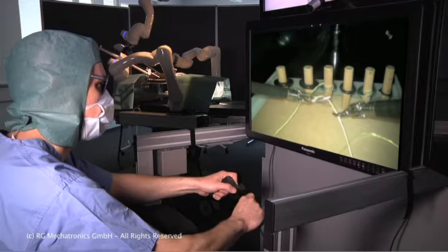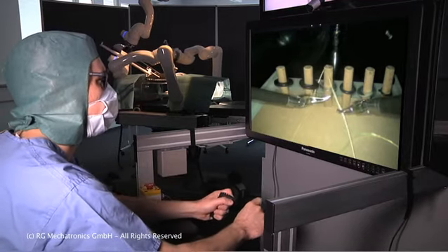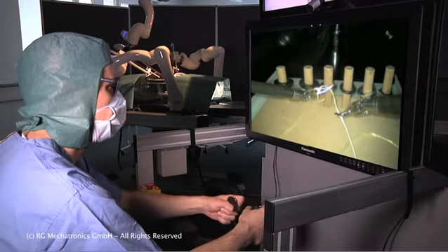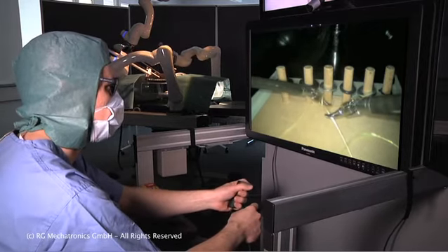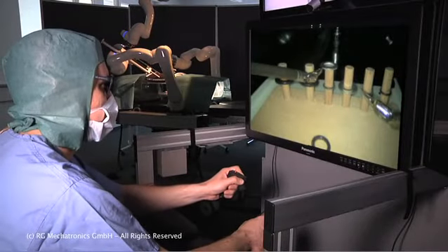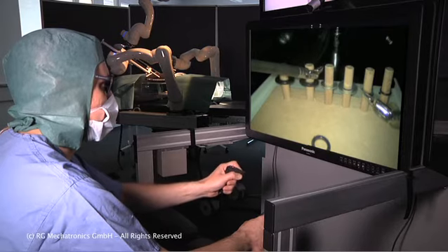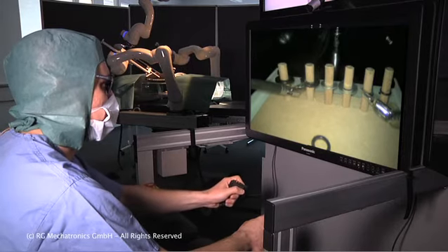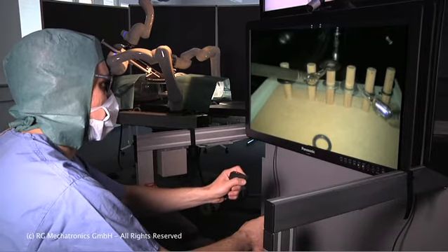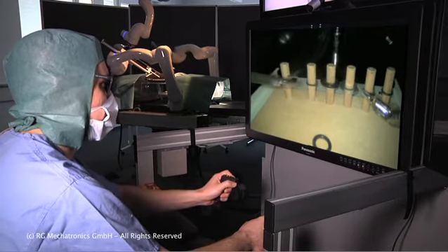Again, tying a knot here. And the 3D display allows him to judge the distance. Now we do another manipulation exercise of putting rings on the pegs. Again, without the 3D display, this would almost be impossible.